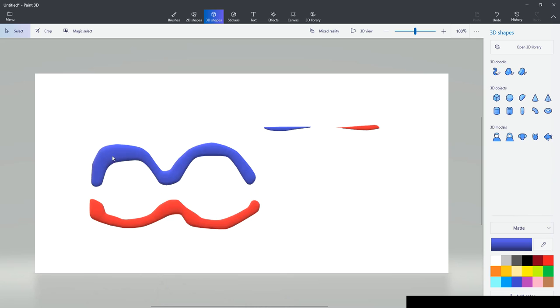If this is the septum, and this is the free wall, we see in diastole the septum and the free wall relax, and in systole they contract. It is normal. In this period we see contraction and relaxation, contraction and relaxation.